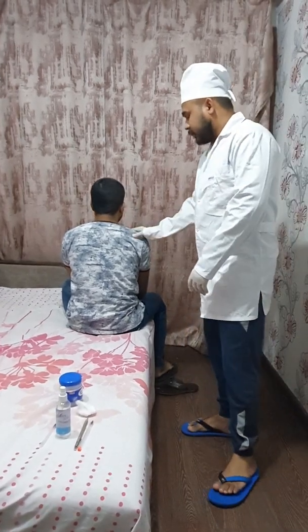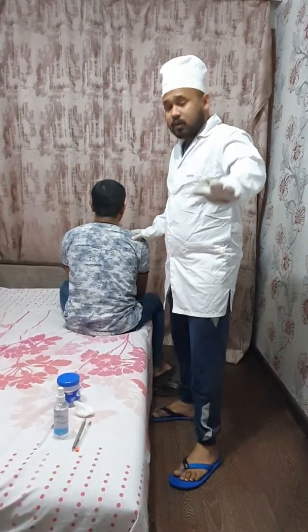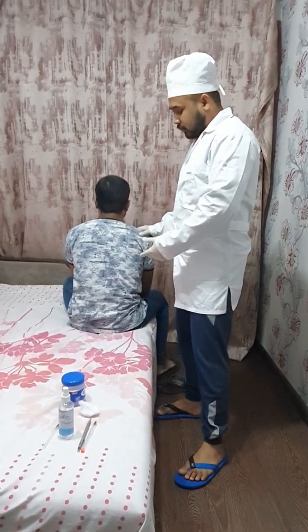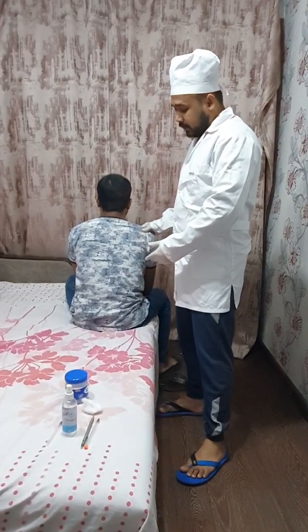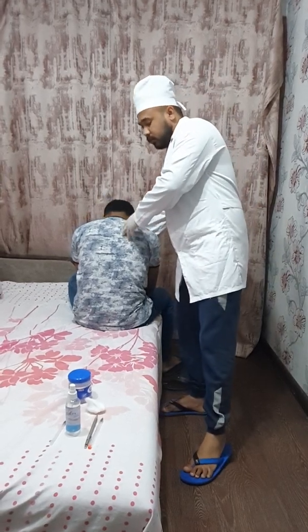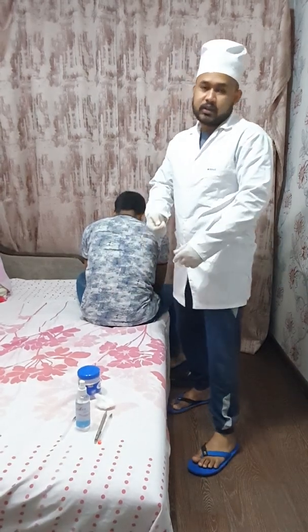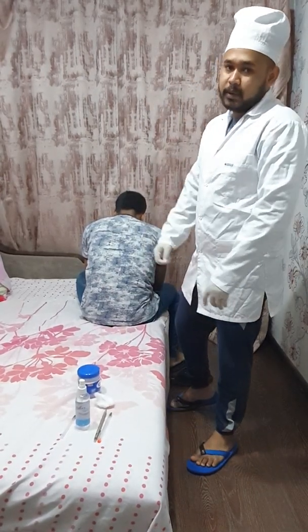First of all, you need to know about the position of the patient. The first position is that I will ask the patient to lean forward, so that the space between the lumbar discs increases, so that we can easily penetrate the needle and obtain the CSF easily.